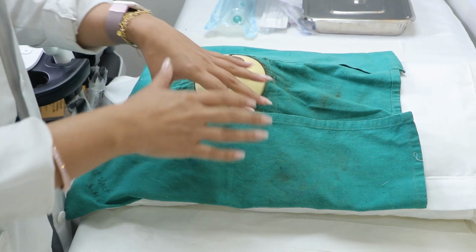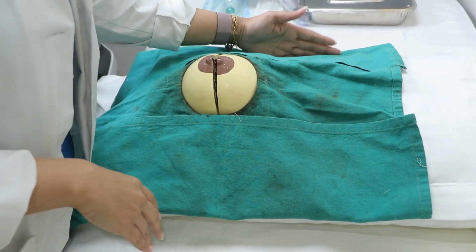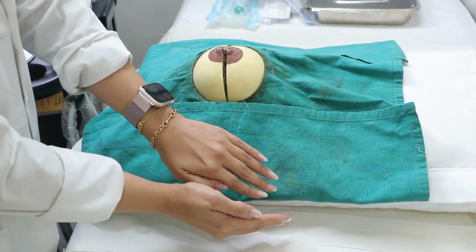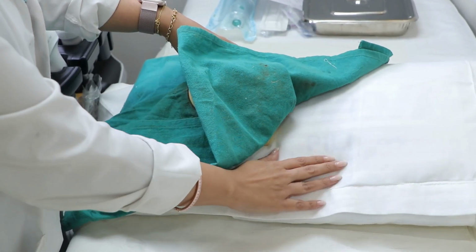Now, as the patient is on this side, we have a demo breast, showing how to position the patient. Unless you position the patient correctly, the lesions can be missed. When the patient is lying down, supine, you have to make sure that the neck of the patient is at this level, the face is here, and the chest is coming like this, so that the breast tissue is exposed exactly how it is on this pillow. As you can see, this is the pillow.